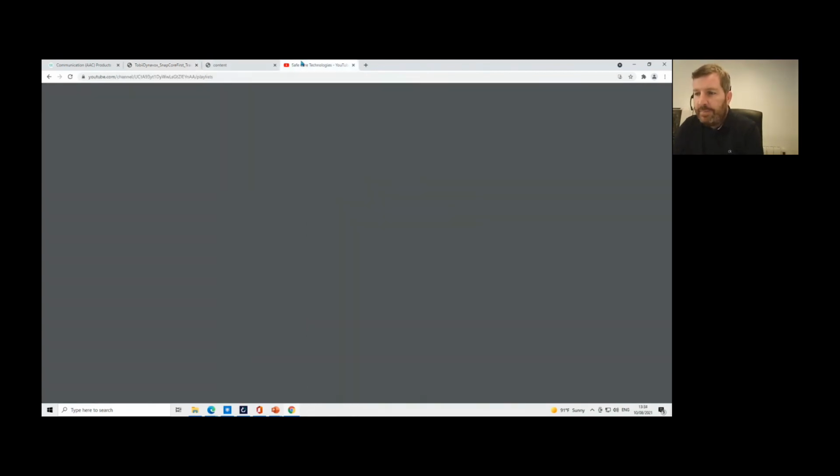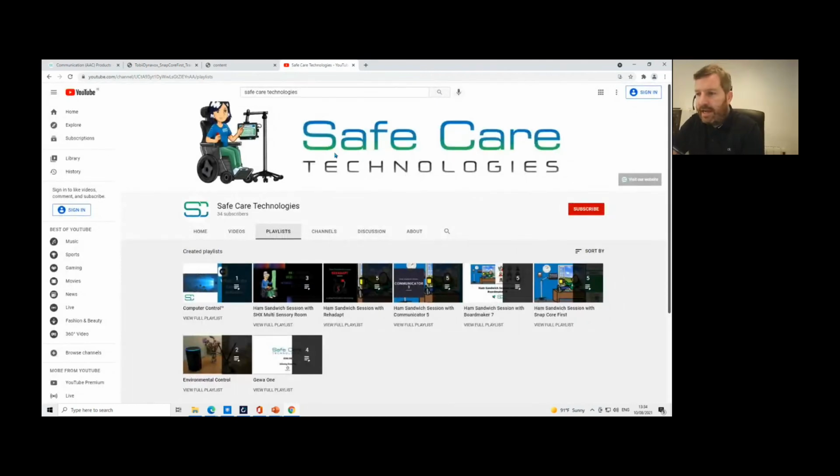So also on our YouTube channel, on the SafeCare Technologies YouTube channel, we have the ham sandwich sessions for Snap Core First, or TD Snap as it's now known. So that'll give you all kind of training on how to get up and running, and they're all very short videos that you can go through. So again, we'll send you the links to this after, just showing you how to kind of find some of these resources.